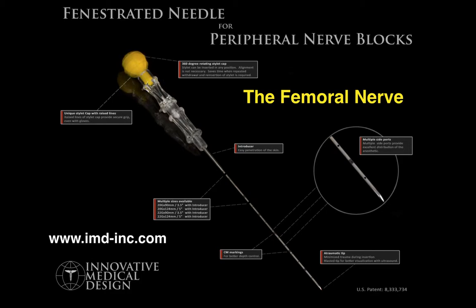The fenestrated needle is just one more tool to facilitate femoral nerve block while maintaining a safe distance from the femoral nerve.